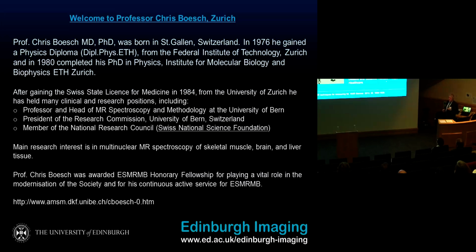Brown adipose tissue would be, or actually is, an extremely important observation. However, here we are far behind radiotracer studies. There are certain ideas about hyperpolarized studies of brown adipose tissue, but nonetheless, when you look at the images, we can see fat, but the distinction between white adipose tissue and brown adipose tissue is very complicated, while a PET radiotracer can show it quite nicely.